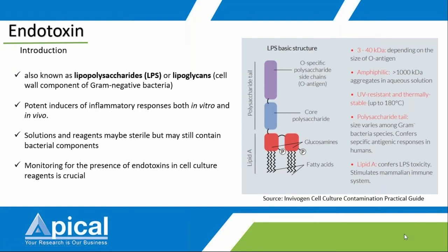So that is where you will find the source of endotoxin. Solutions and reagents may be sterile. You think they are sterile, but sometimes they will still have components of bacteria, that is the LPS. So monitoring for the presence of endotoxin in cell culture reagents is extremely crucial.